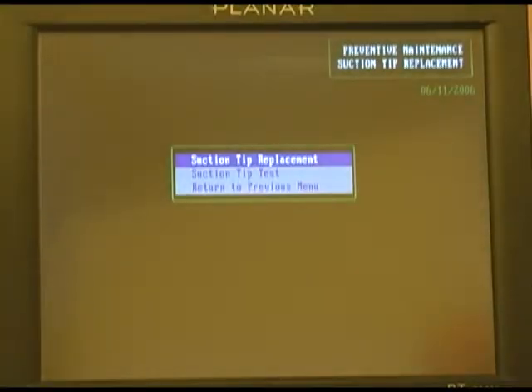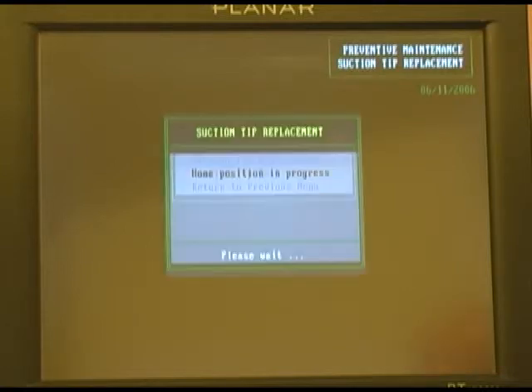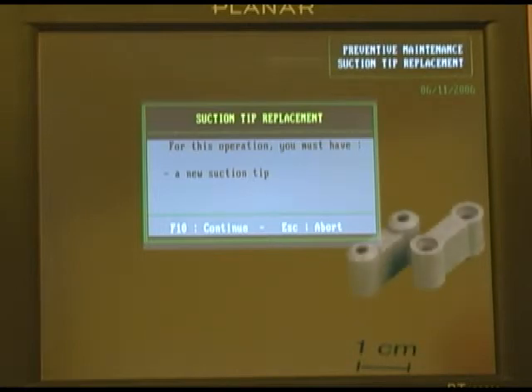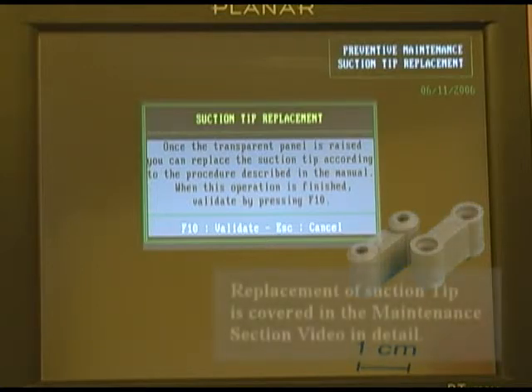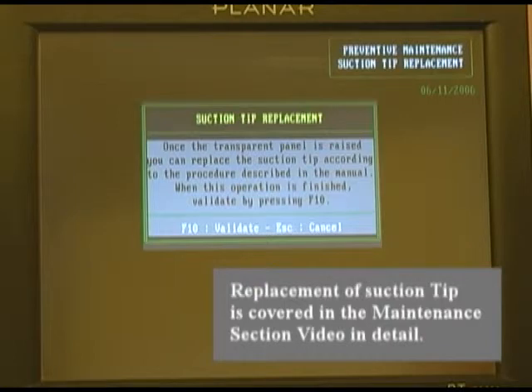If the suction tip needs to be replaced, follow the instructions as indicated. Let's highlight suction tip replacement. For this operation, you need a new suction tip or gripper. If you have that, press F10. The instrument is going to move the gripper arm forward. At that point, you can open the transparent cover, replace the suction tip. When you've completed this task, press F10.